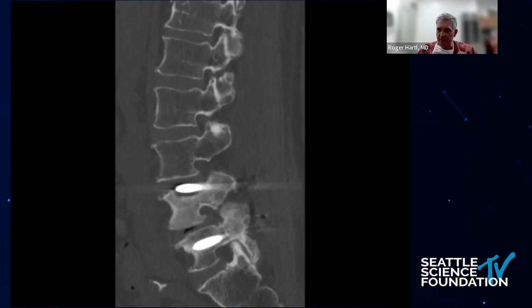But when I use it, I use one small sponge and I put it all the way in the front of the disc space. Then I put autograft bone. I always use autograft bone from the facet. I use expandable cages. Then I backfill the expandable cages with bone graft. So the BMP is far away from the dura. But I use BMP maybe in 10% of cases. Again, patients where I'm really worried about the fusion.